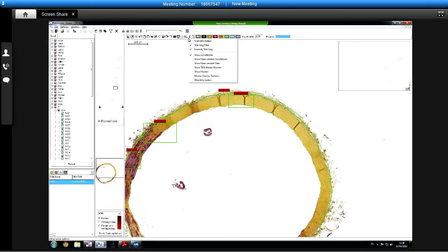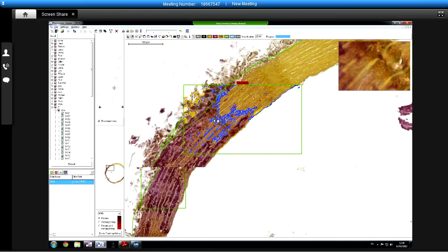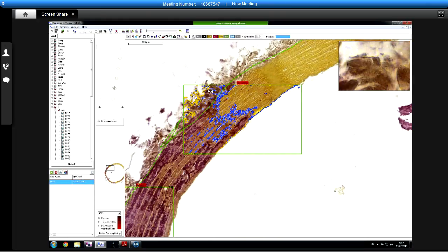I'd only do one section per slide. Oh, that's interesting. The yellow is the red layer, but the blue is the yellow layer. Does that make sense? It does seem to have ignored the red. Basically every bit of tissue has come up in the yellow layer, which is what it was doing before. But the thing marked in blue does have the look of what you would call positive, isn't it? It seems to be just marking this bit here and some little strips in the middle.